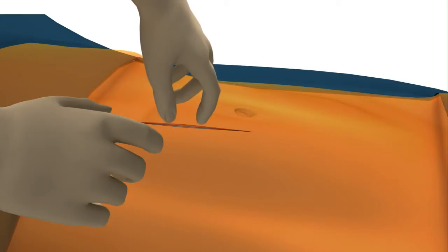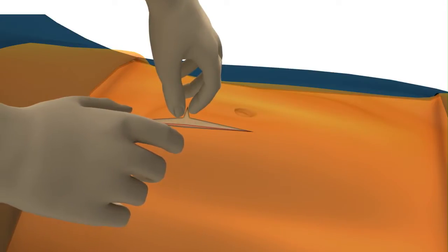Prior to skin closure, pinch the drape film near the edge of the incision to create a crease. Pull up on the crease and gently separate the drape from the skin at the incision edge.